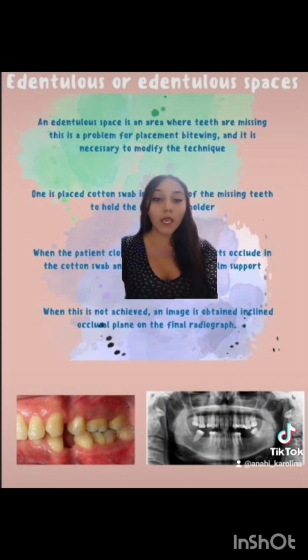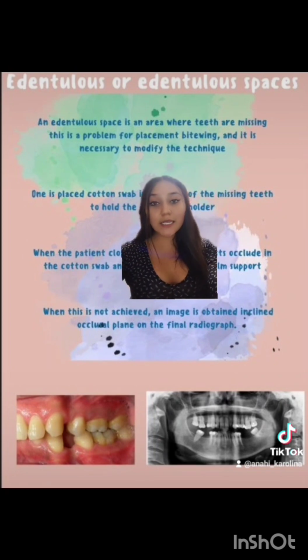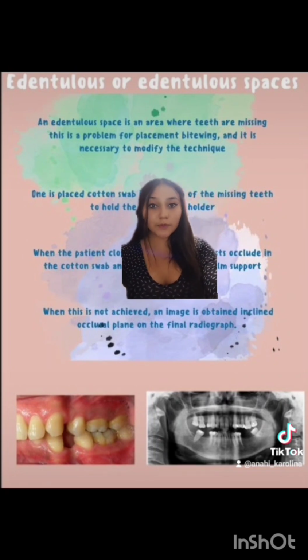There we can see a radiograph of a dental patient. That is a panoramic radiograph, where we can see a space of the teeth.